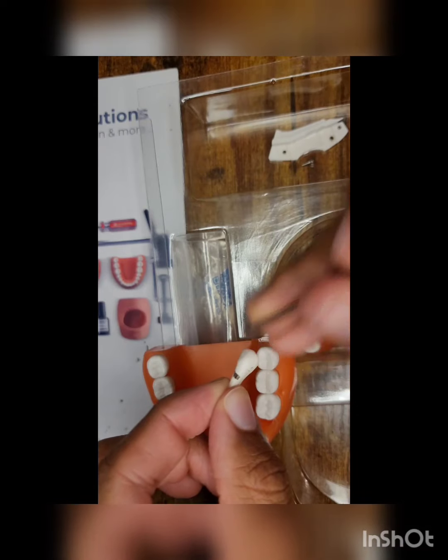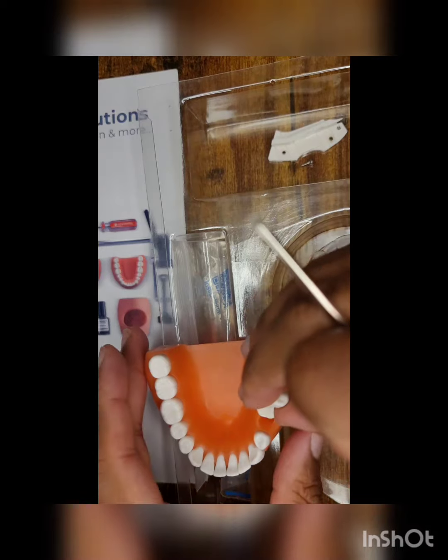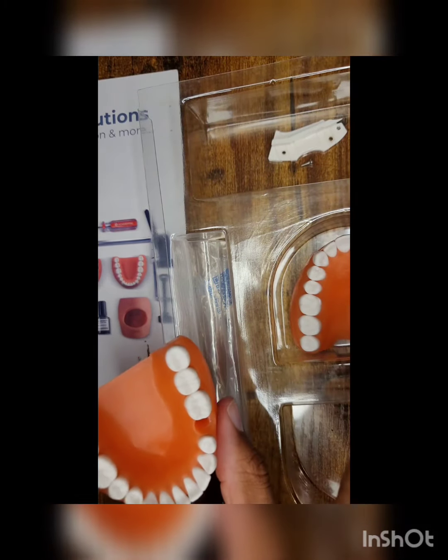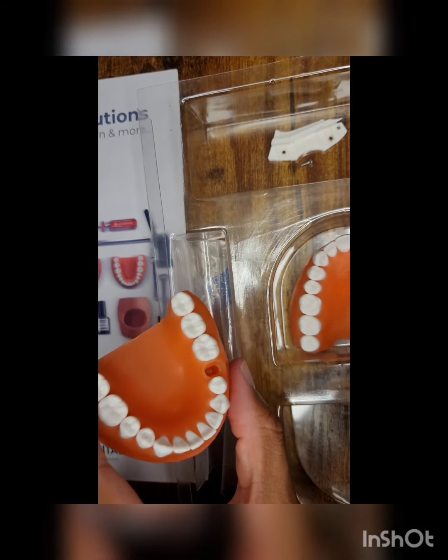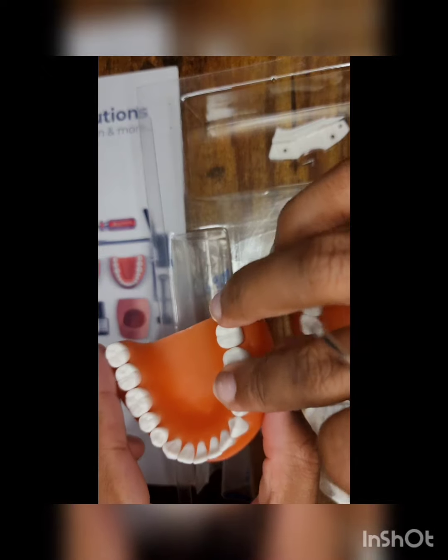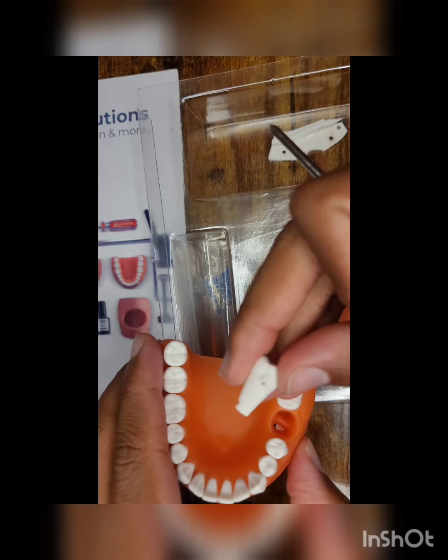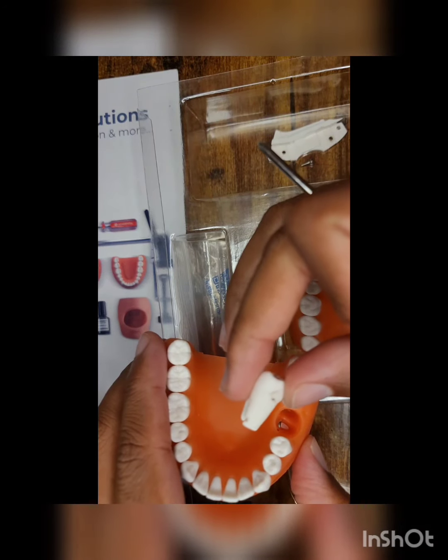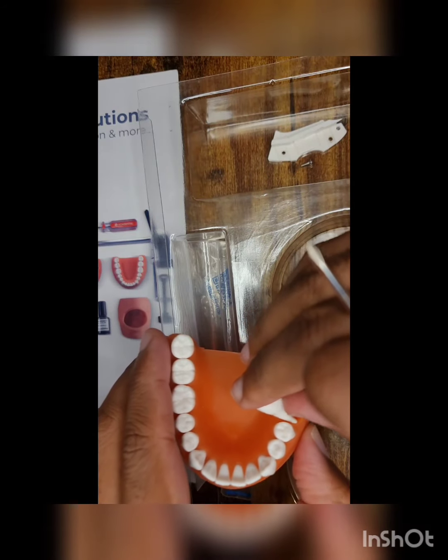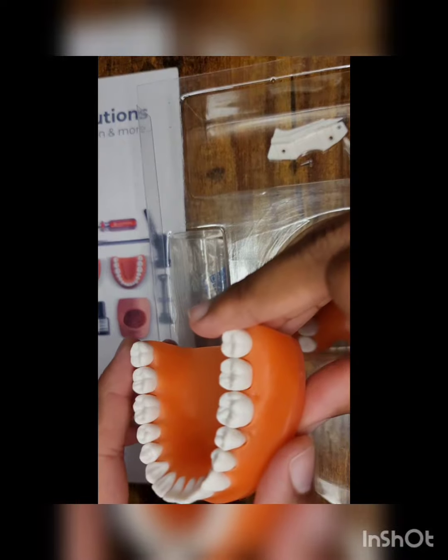So if you stick in your probe 5 millimeters and check to see it's all smooth, you are good. I remember I kept seeing a little bit of lines and kept digging at it and digging at it — I had the most trouble trying to get everything out. You don't need to actually go beyond what you can feel, which would ideally be 5 millimeters. There is some staining from the simulated calculus which I applied, but it is passable because it's only treated as staining and not as calculus or anything else that is still there.